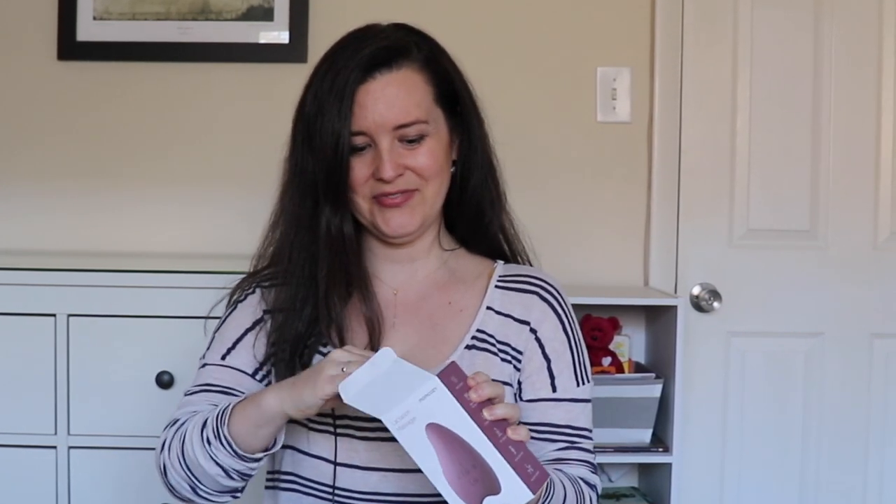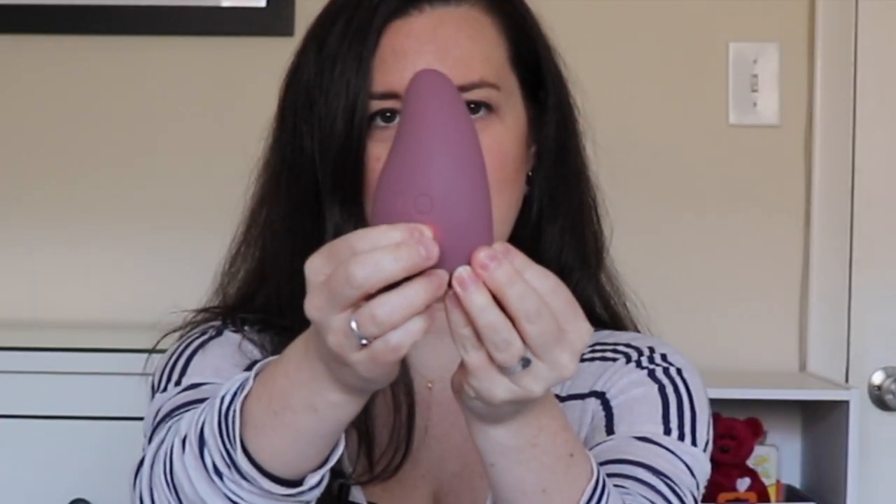So let's go ahead and open this. It comes in this little tray and it has a magnetic charger here, so you just plug it in and it's good to go, but it does come a little bit charged. You turn it on here and it starts in one vibration mode. You kind of have to do a long press to get it to start, and then you do short presses to switch from one vibration mode to the other.